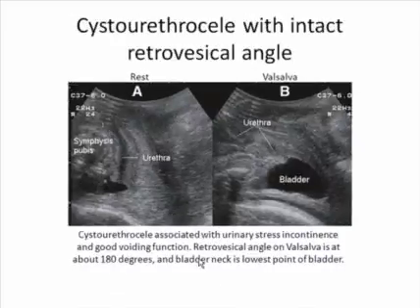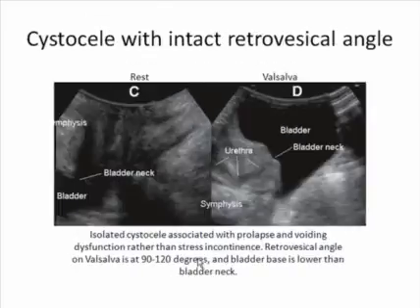The urethral angle exceeds that 120 degrees that we talk about, and I recommend referring to his excellent works that are in multiple journals. In fact, his excellent book, which I think is a classic already for looking at urethral and pelvic floor disorders, and these images are from his book with his kind permission. This is a large cystocele, as you can see here on the Valsalva. There's a large cystic structure, which in fact is the bladder coming up right next to the transducer.